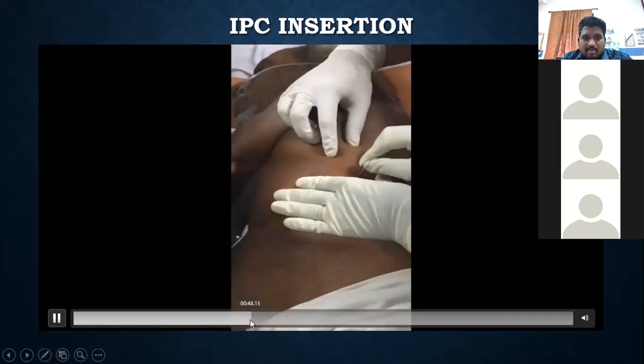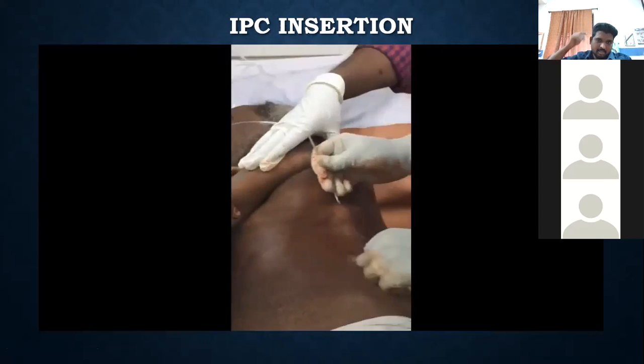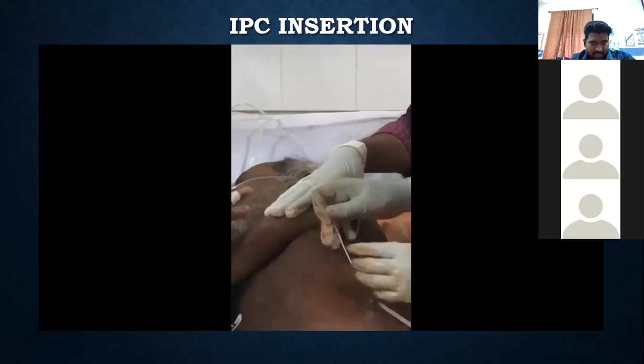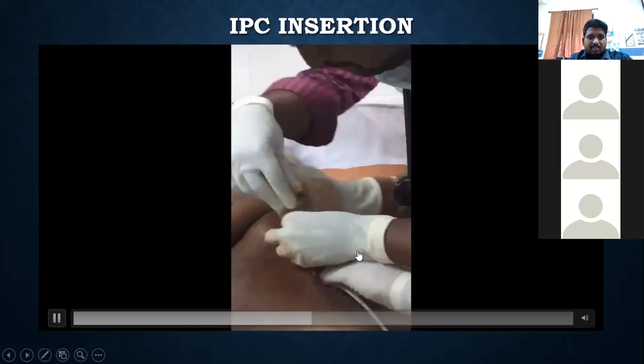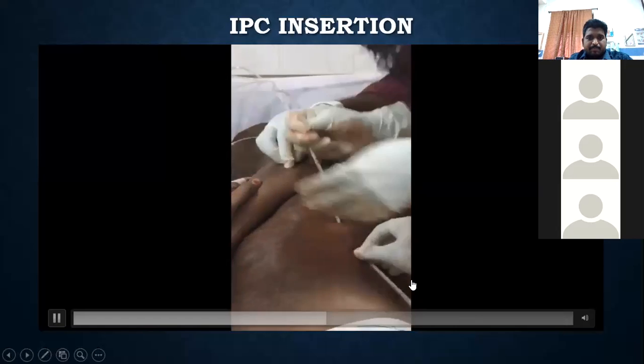See, actually, this is a big video. The only thing is that here the catheter is buried into the subcutaneous space. You could see that it's somewhat of a painful procedure. I think we need to anesthetize the area, the subcutaneous area. It's also a very simple procedure, a very good procedure. Actually, it is very simple, and it's good for the patient, except for the cost.